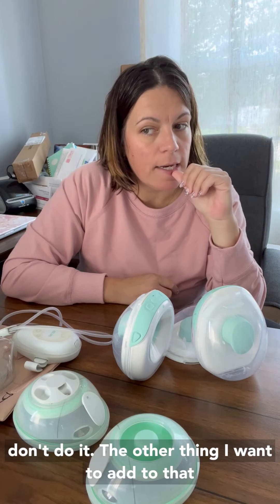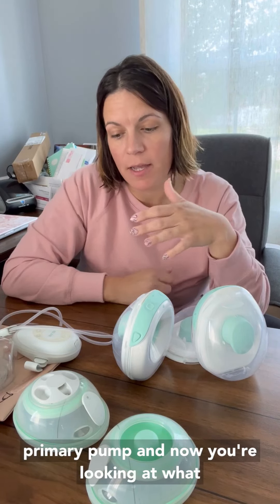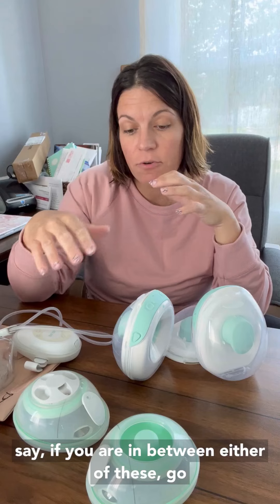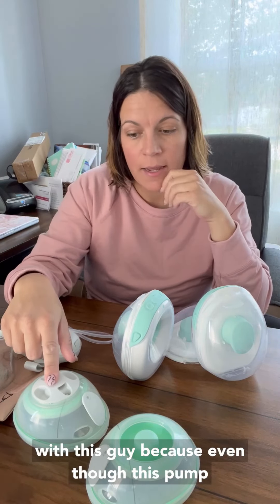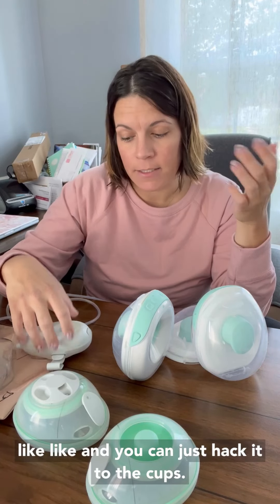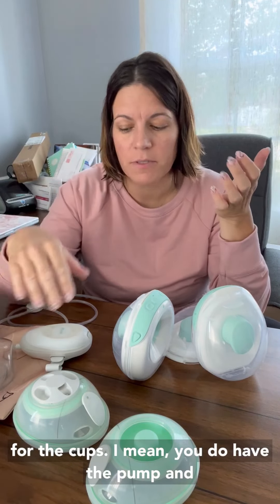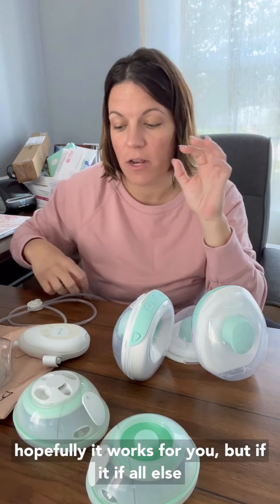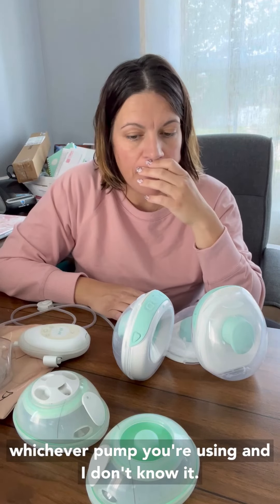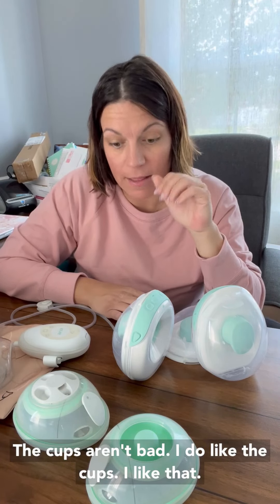The other thing I want to add is if you already have a reliable, good primary pump and you can use the insurance for something else — if you're in between either of these, go with the LV Stride. Because even though this pump isn't great, hopefully you already have a pump you like and you can just hack the cups to it. So you're really using your insurance for the cups. You do have the pump and hopefully it works for you, but if all else fails, you just hack the cups to whichever pump you're using. The cups aren't bad — I do like the cups. I like that they don't leak.